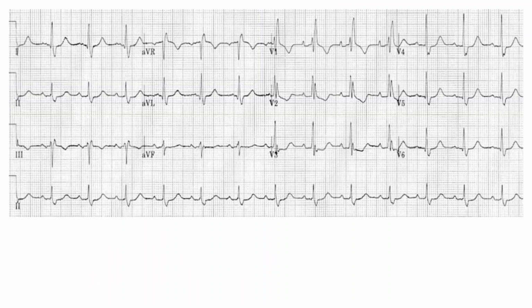Okay. If you see this ECG, you can see there is a predominant positive wave in V1, and you can appreciate the RSR' pattern. So this RSR' pattern is important. In case of left bundle branch block, we were using the term dominant S or dominant R, but in case of RBBB, we'll mostly use RSR' pattern in V1 and a wide slurred S wave in V6, as you can appreciate here.